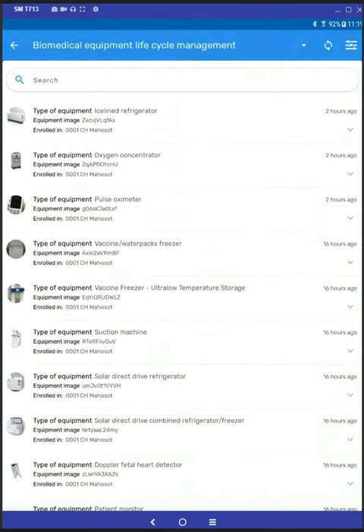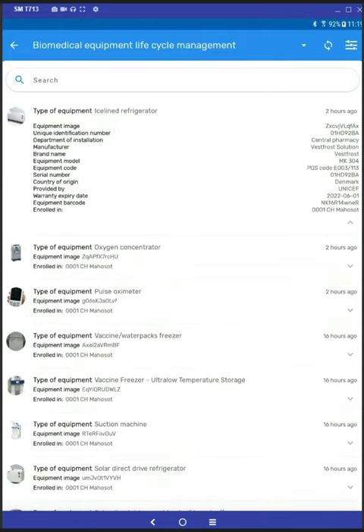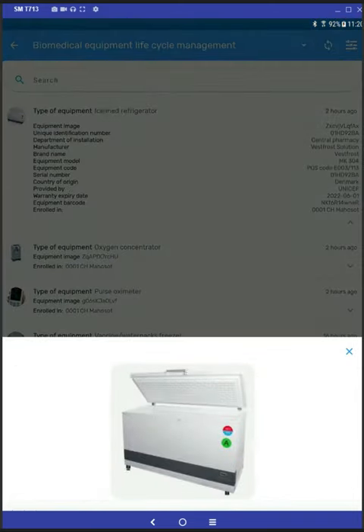So you see here a list of all the equipment in a clinic or hospital. If you tap on the expand menu, you have all the equipment details for that piece of equipment. You can also tap on the small icon and it will show the equipment image in a pop-up.